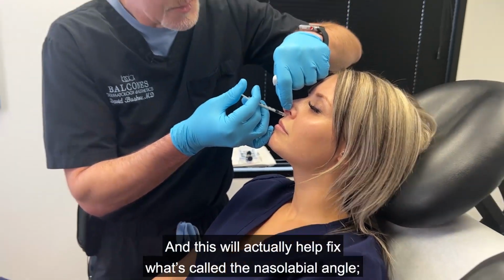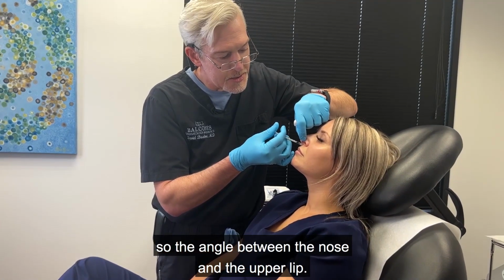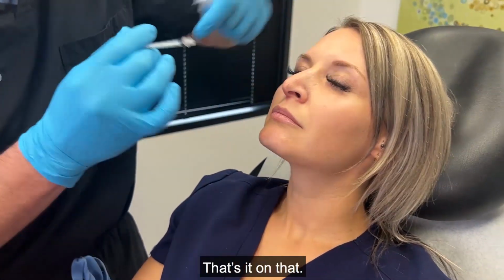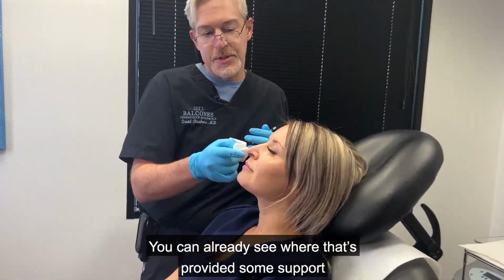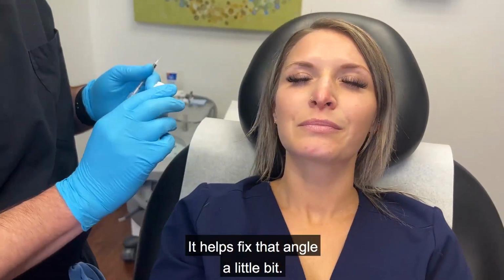And this will actually help fix what's called the nasolabial angle, so the angle between the nose and the upper lip. That's it on that. Oh good, no bleeding. But you can already see how that's provided some support underneath her nose, and it looks a little more straight and helps fix that angle a little bit.